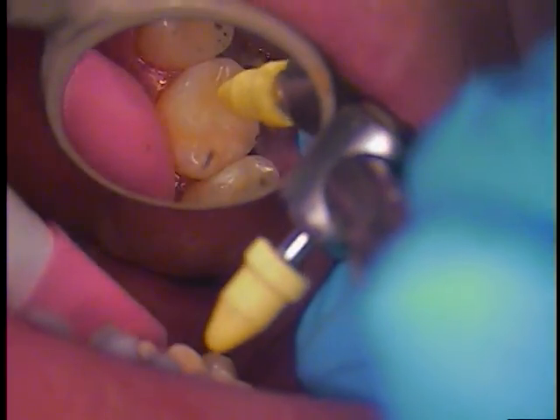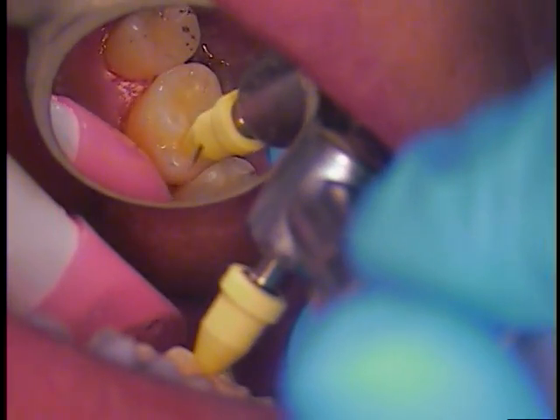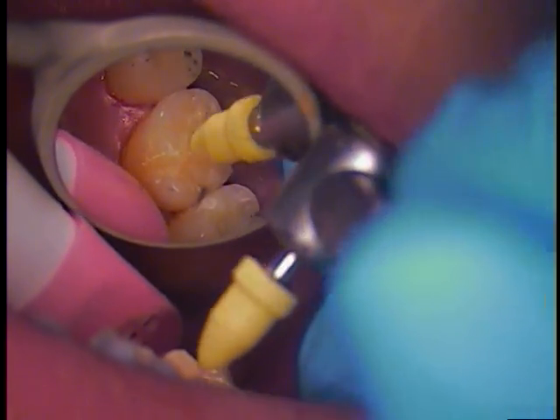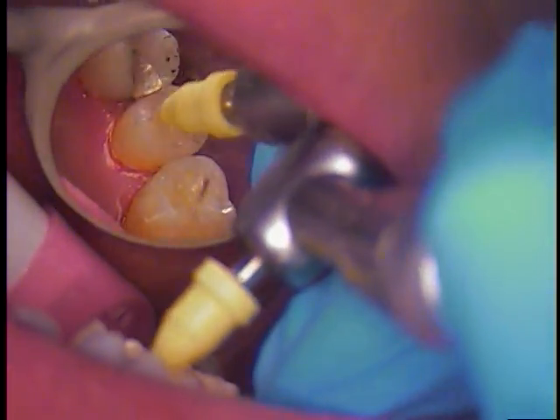Hello and welcome back. This is Dr. Jerry Cuomo. I'm now going through the polishing techniques that I will use. I like the Centrix points — they work pretty well. They just give a nice surface buffing.